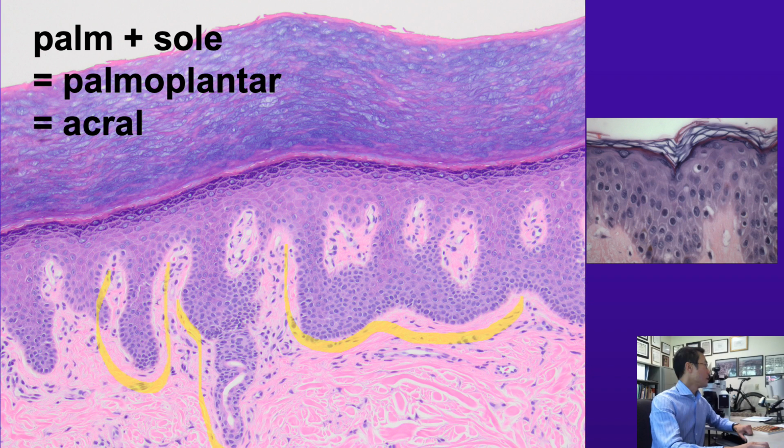Here's an area where an eccrine sweat duct is connected to the epidermis. This connects through to the surface where the sweat is excreted in an area known as the acrosyringium. And on acral skin, it has another name as well, the crista intermedia or crista profunda intermedia.